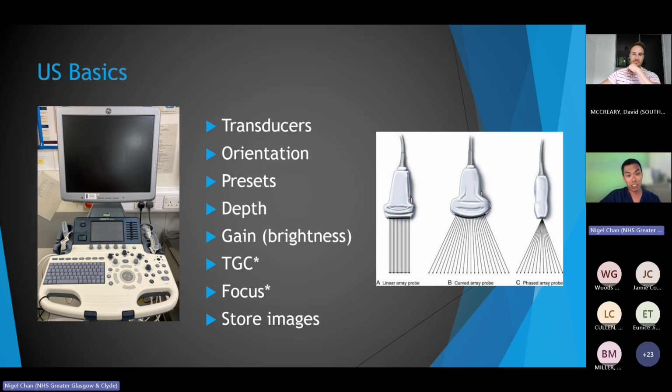And lastly, find out how to save images, in terms of actually freezing them, taking screenshots, taking videos, and how to store them in your machine and take them on a memory stick, or if it's really old, a CD drive like R1 has.